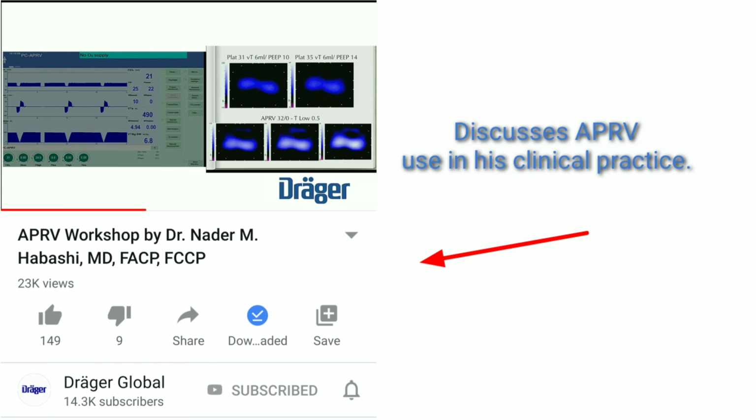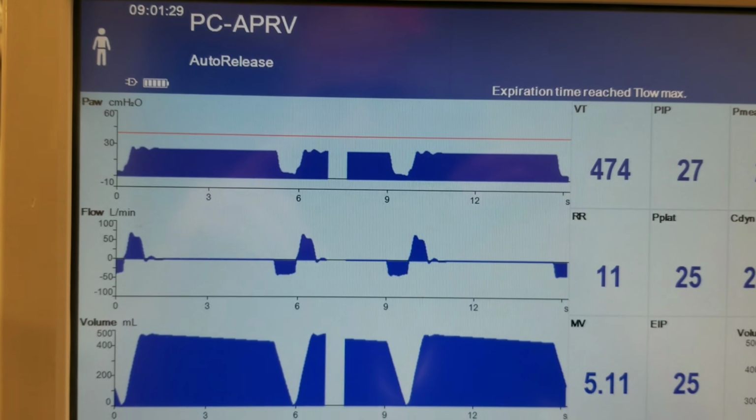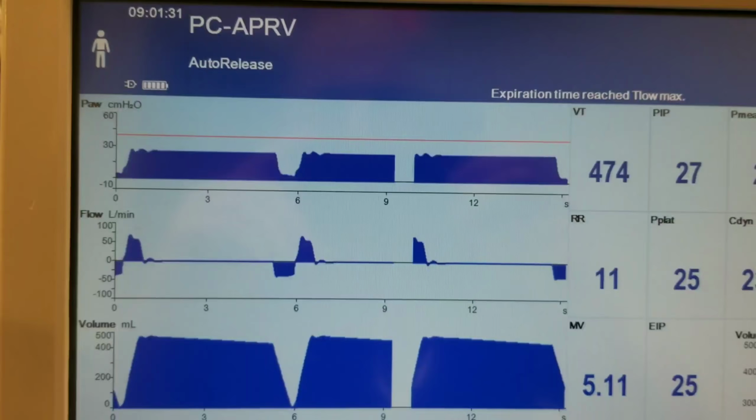Keeping in mind, guys, that P high, when you get the releases, you're really dropping pressure. Notice in conventional mechanical ventilation, positive pressure ventilation, each inspiration is a positive pressure and then a return to base. So we're blowing the lung up a lot like a balloon. Here, we're regaining the patient's FRC and we're allowing a release to evacuate. So it's like an opposite. To release the breath, to me, seems much more protective.